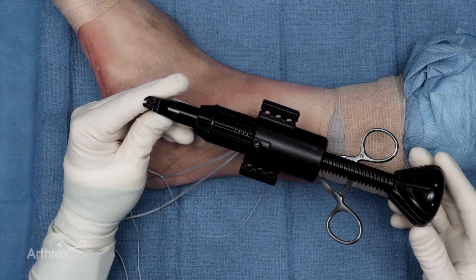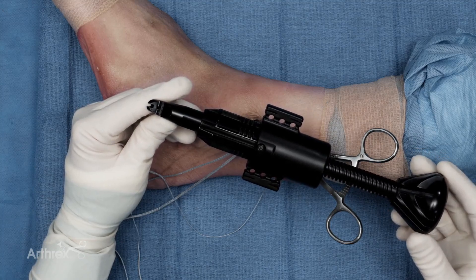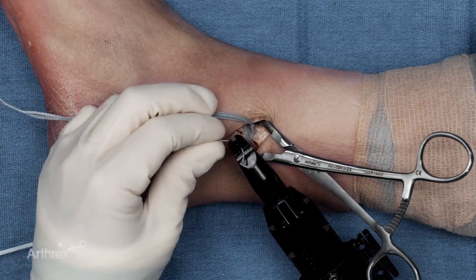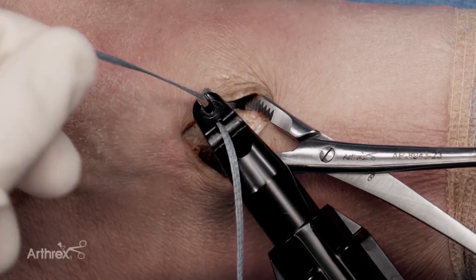Now that the fiber tape cerclage has been passed twice around the fibula, I'm ready to tension it using the disposable tensioner. I've now cut the end of the fiber tape cerclage to provide two different tails.